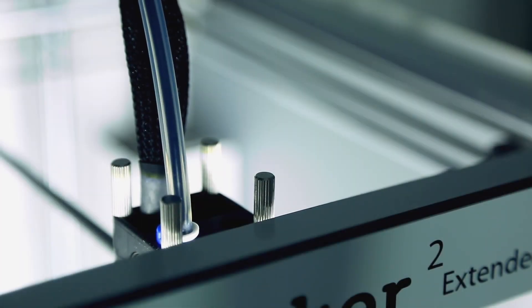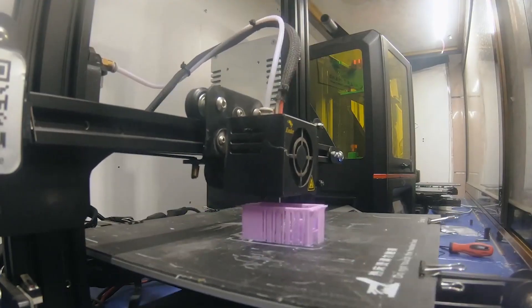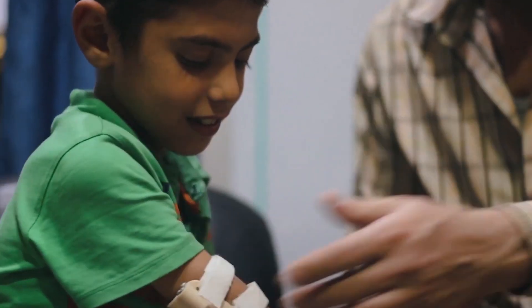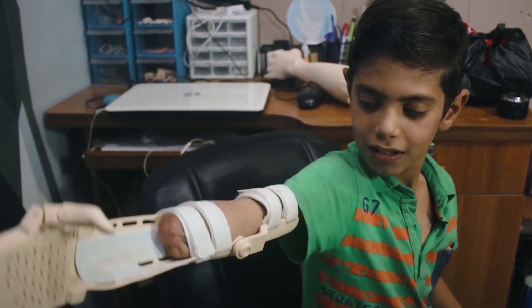At present, the ENABLE volunteer community is using desktop 3D printers to make prosthetic devices for those in underserved communities. In doing so, they're providing a solution that the larger medical device companies have not been able to address.